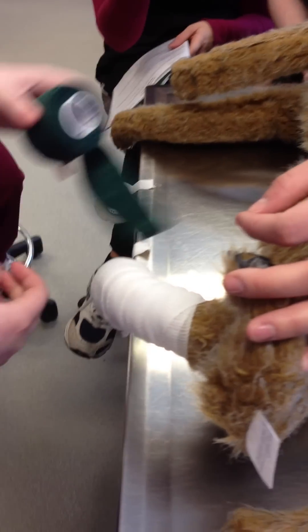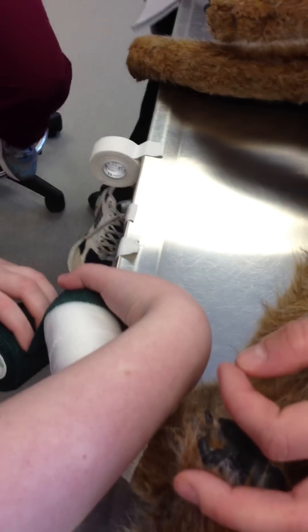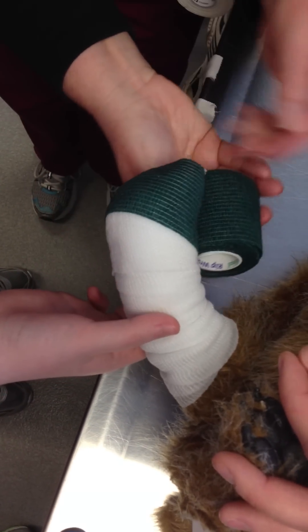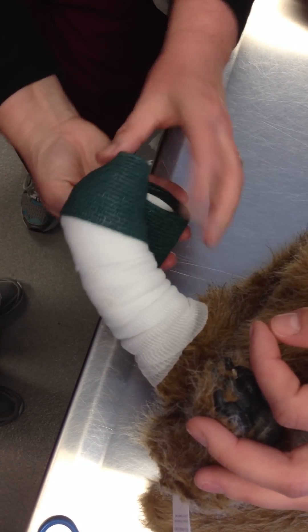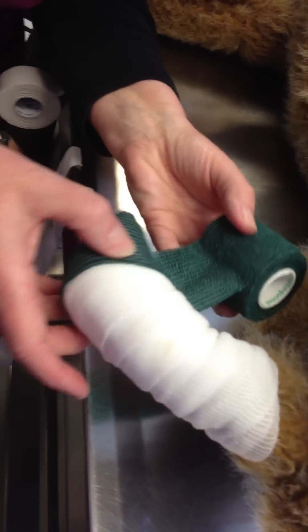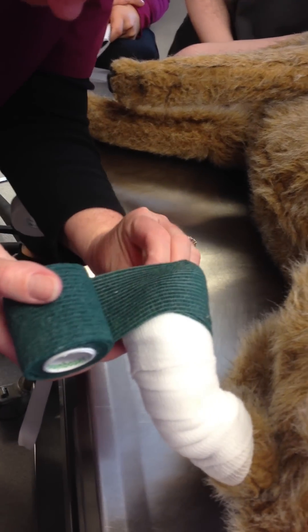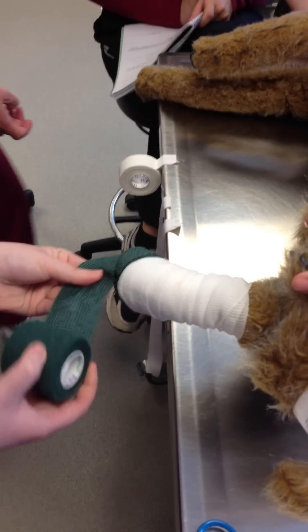When you're starting a bandage like this, you get that little flap and go around and catch it. I'm going to put it on with a little bit of tension, sort of go around and catch it like that. You're going to have to make sure that you get all of your conforming gauze covered. I would have been maybe a little bit more conservative in how far down I went with my gauze, so that I could have a couple of millimeters to extend my vet wrap out.